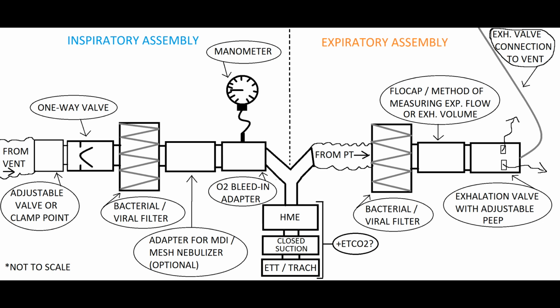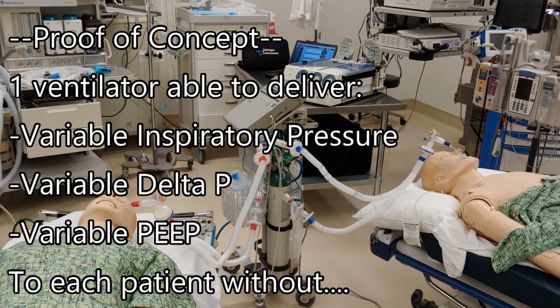Right here is just a quick shot of the schematic of the inspiratory-expiratory assembly, just so that anybody who's jumping into it with us right now kind of has an idea of how we're getting this to work. Again, this is detailed in the first and second videos as well. So before we play the actual video, I just want to cover what the proof of concept here actually is.